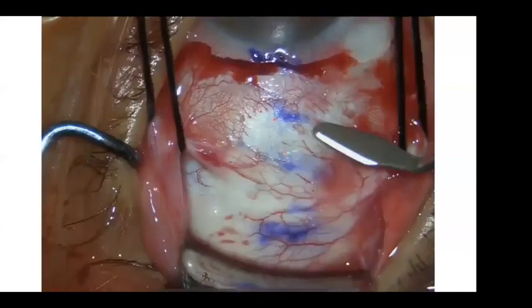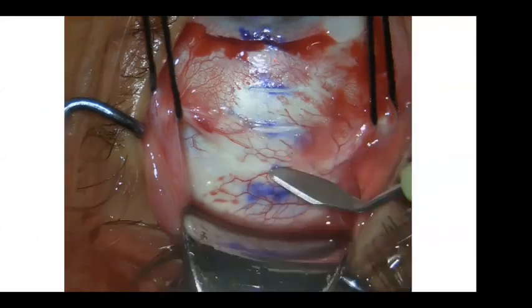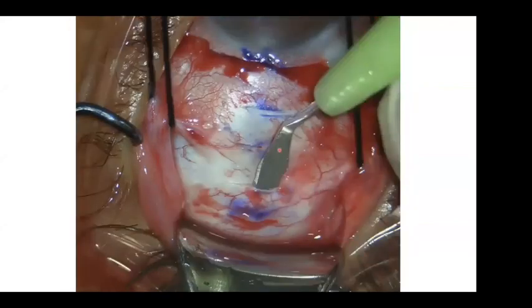And then I create scleral incisions using the crescent. The crescent is a very helpful dissector for the sclera, but beware if the crescent is very sharp, because it can cut through the sclera, as I'll show you next week, inshallah. Then I divide this area again into 3 millimeter areas, and I start dissecting tunnels. When I dissect the tunnel, I use the crescent blade on the surface of the sclera. I don't use it perpendicular. The foot is just resting on the sclera, so I'm applying pressure on the sclera while dissecting.